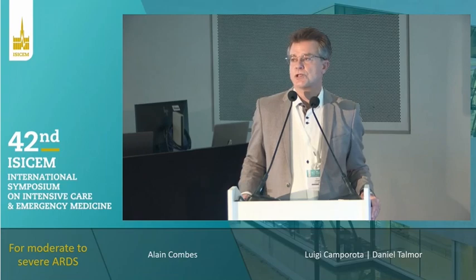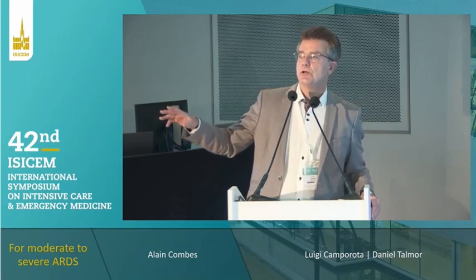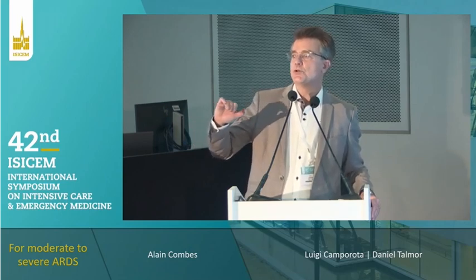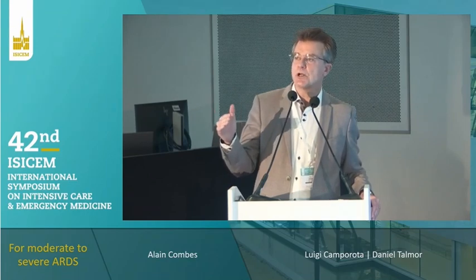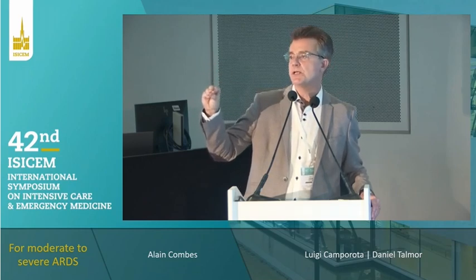It's two very important questions here. First, citrate for now is limited to extracorporeal blood flows of less than 200 ml per minute. And those new generation ECCO2R devices, the low flow devices, which are running on a CRRT platform, usually to reach some significant ECCO2R, you need to reach at least 300, 350, 400 ml per minute. So at that level of blood flow, it is not possible to use citrate.